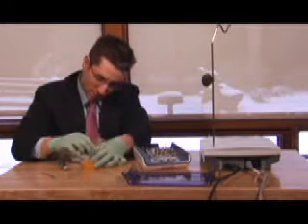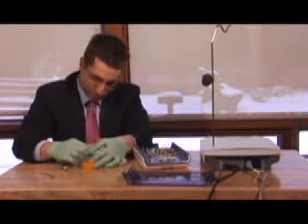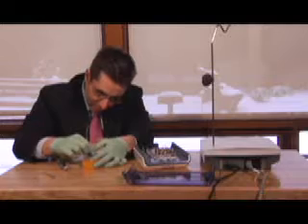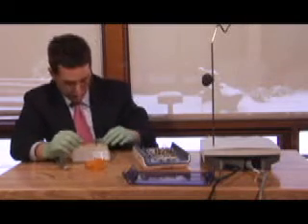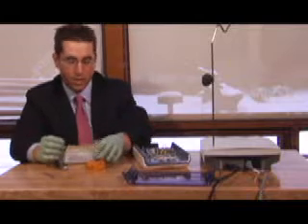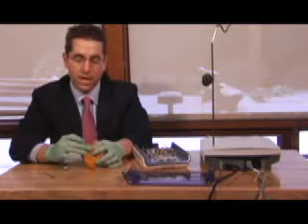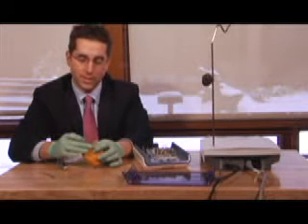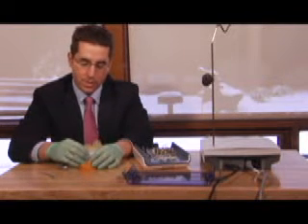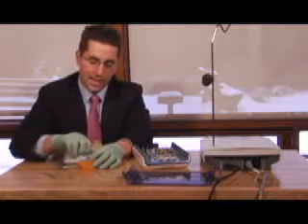The top of the screwdriver is stabilized. And in this case, this is a rather large healing abutment. The examples that we have here, in working in a patient's mouth, you would use probably a 2 millimeter healing abutment, something shorter that wouldn't be above the level of the adjacent tooth. But that's just for this exercise to show you that a healing abutment would go back on top of it.